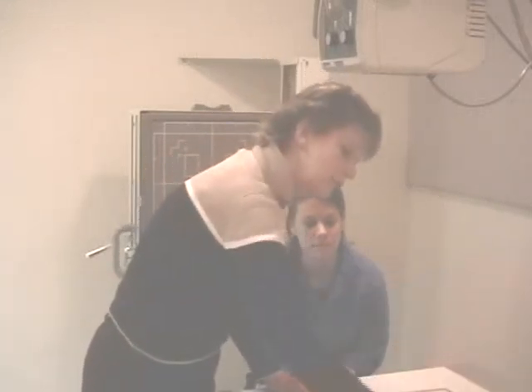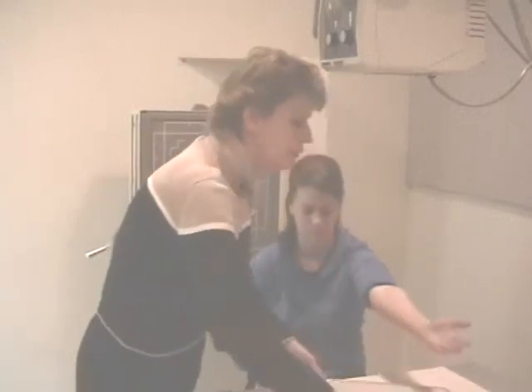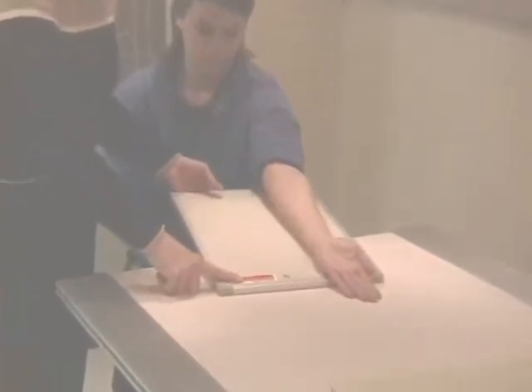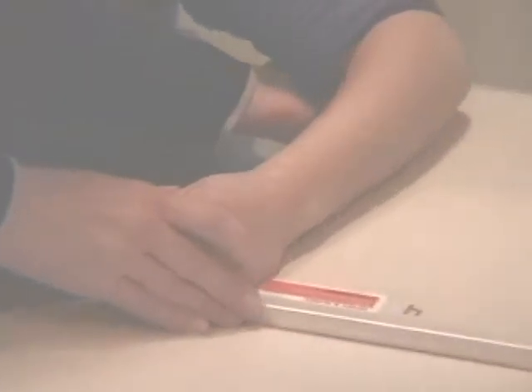Okay. Proximal forearm. I'm going to reverse the cassette, proximal forearm, so the ID blocker is towards the carpal bones. I will put the lateral here so the humerus can go off, and the AP over there. Okay.